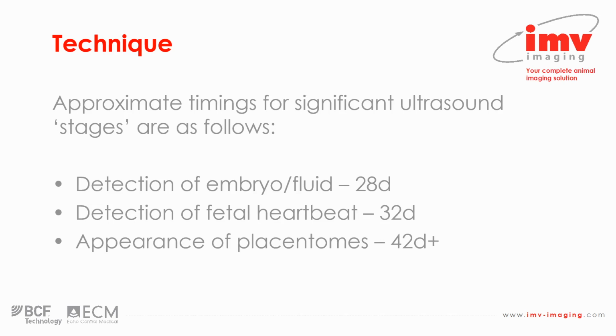Just a few approximate timings for significant ultrasound stages when you are performing this process in practice then.